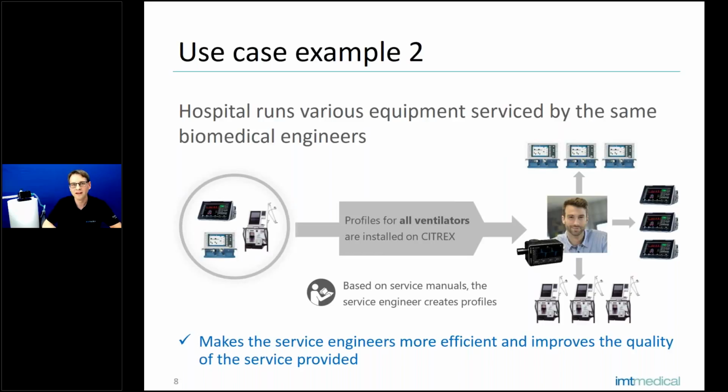So also here, the information about the profiles is based on the information of the service manuals of these various equipment in this hospital. So you can imagine this helps the service engineers to work more efficiently because they will be faster, and it makes it safer to use. And at the end, it also improves the quality of the service provided.